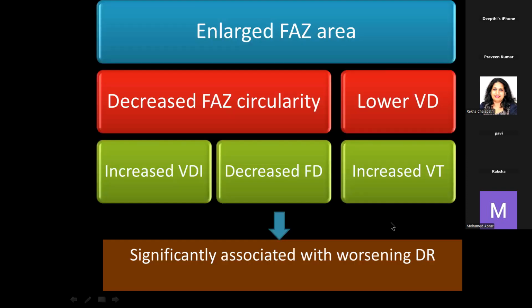What are the OCT biomarkers which say that the patient is having worsening diabetic disease?